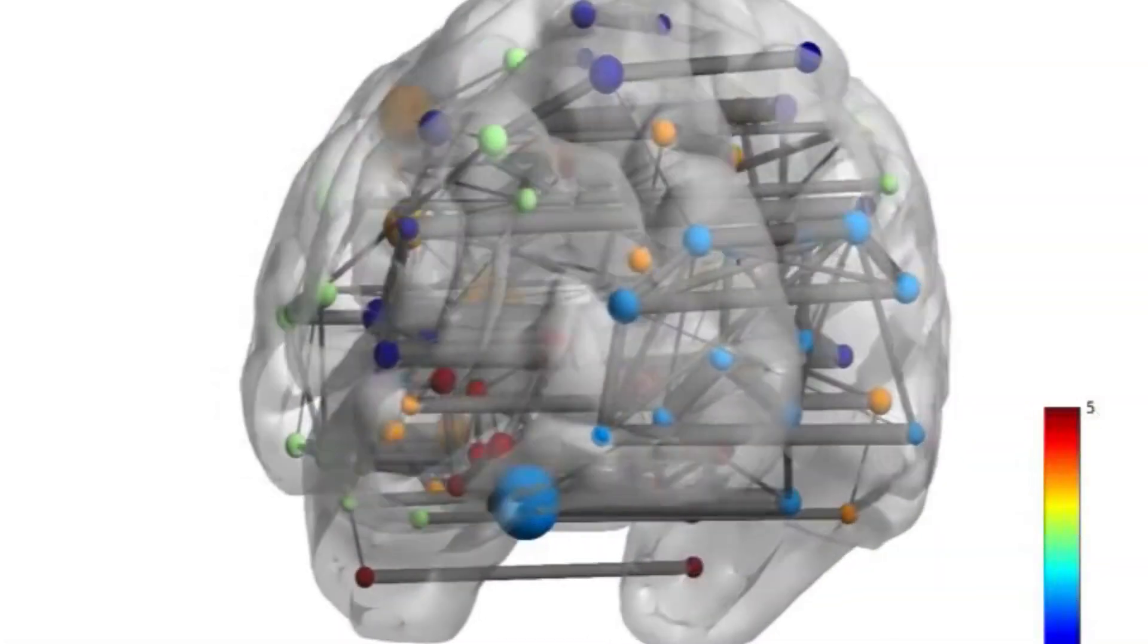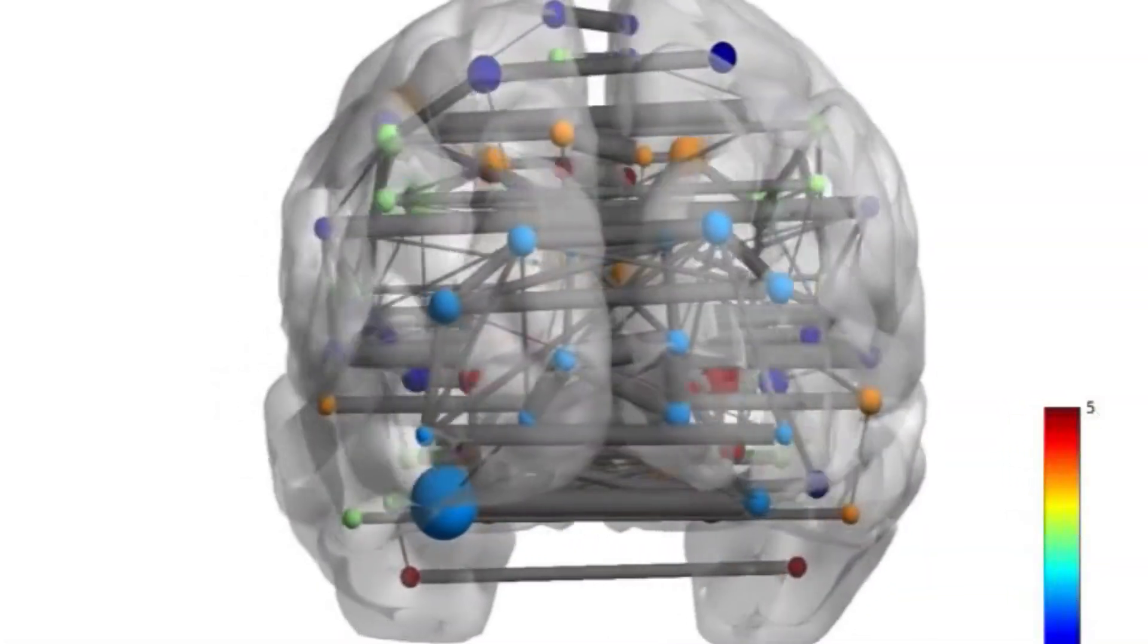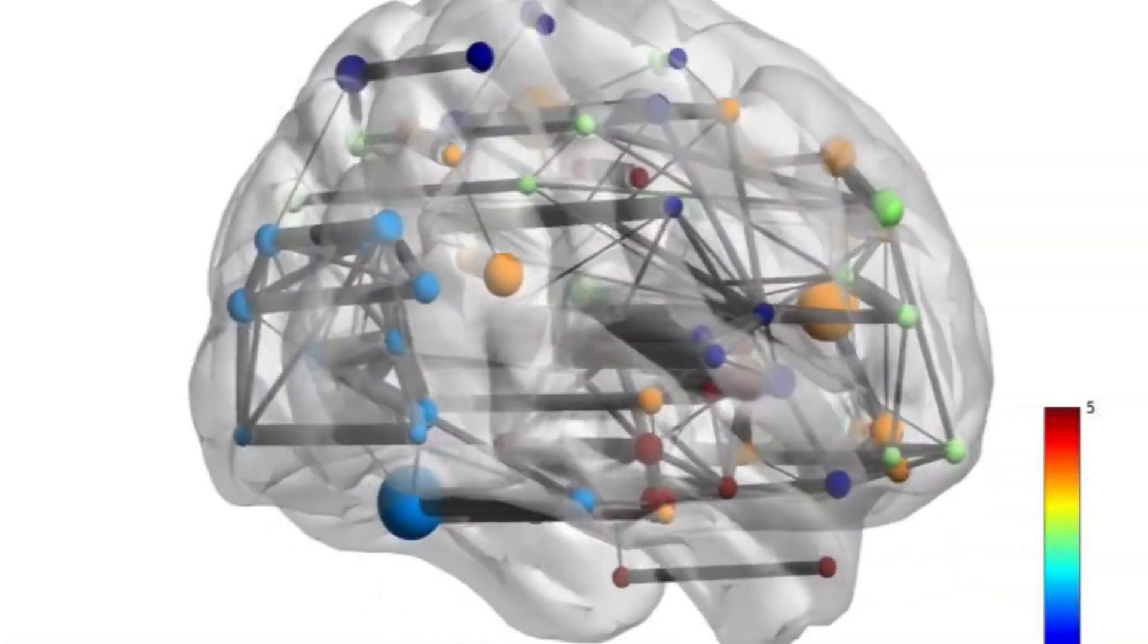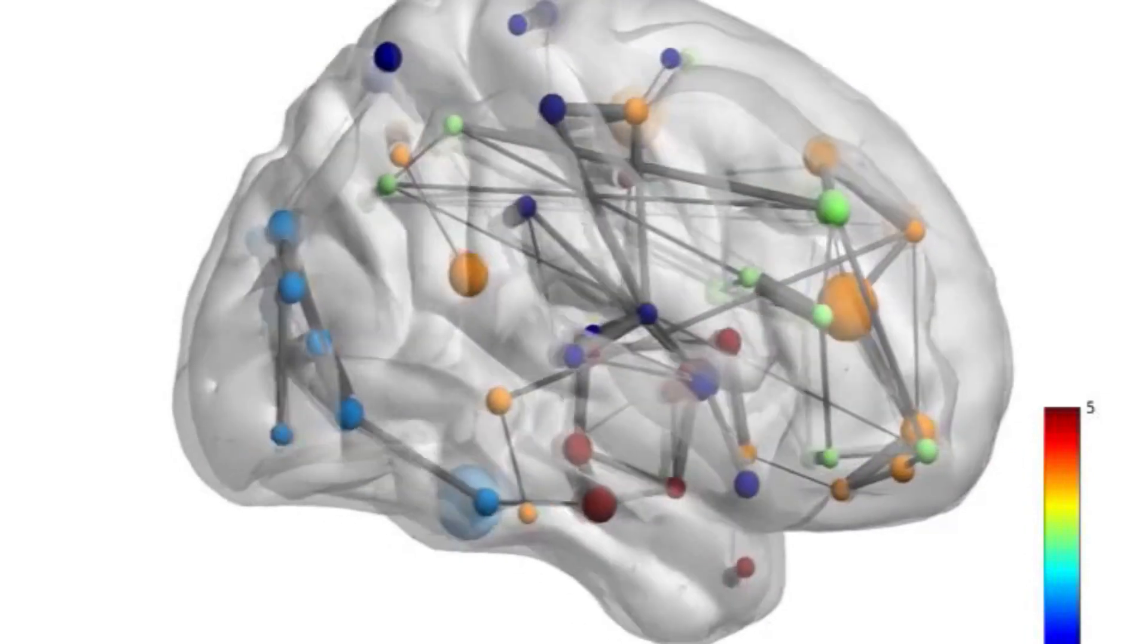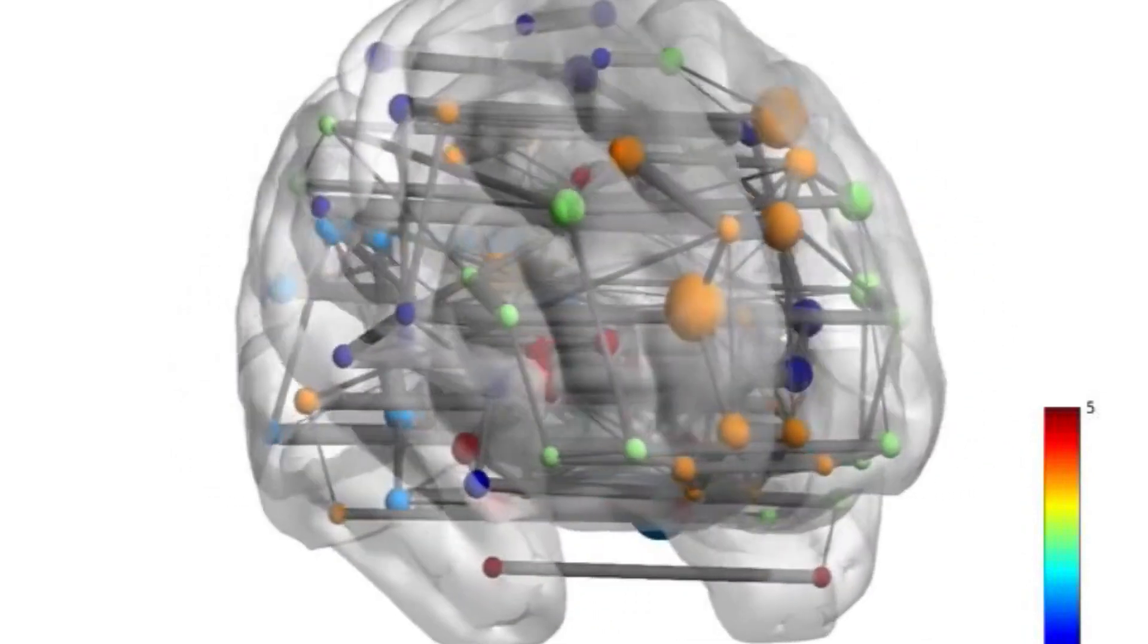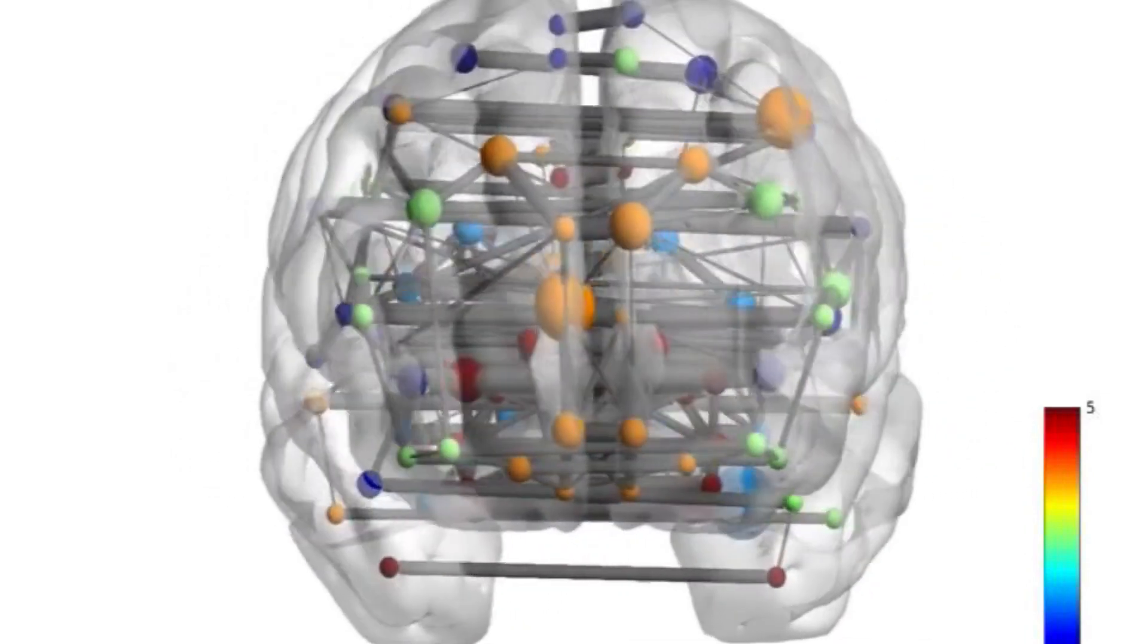In my research group we work on brain connectivity, often based on structural data from magnetic resonance imaging. We're given a sequence based on diffusion.